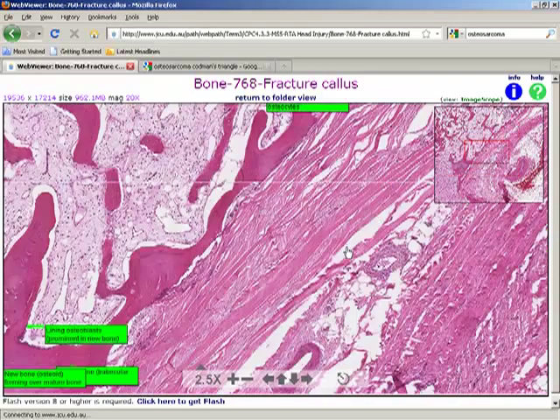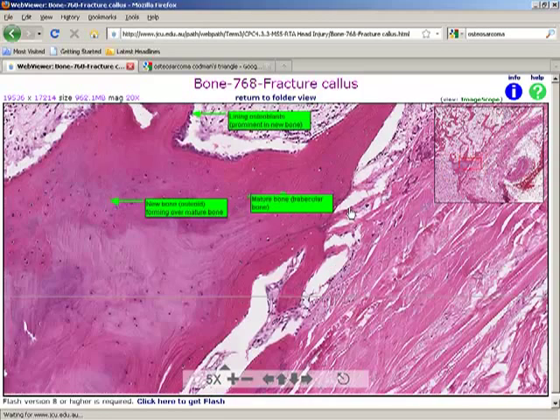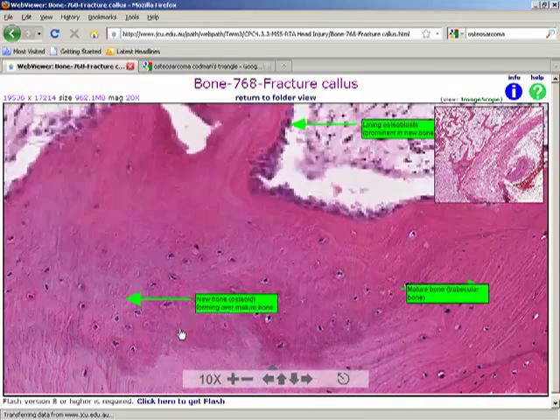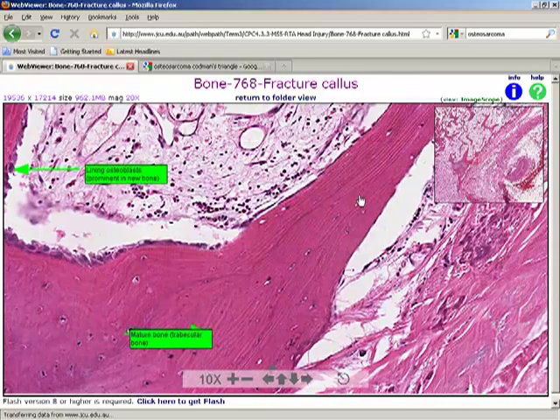Okay. Now this is to show you the normal bone and the irregular bone. That's a new bone. It is the end of a fracture. Now if you see this part, okay, you can see the fine lines, trabeculae and osteocytes. So this is a normal bone.